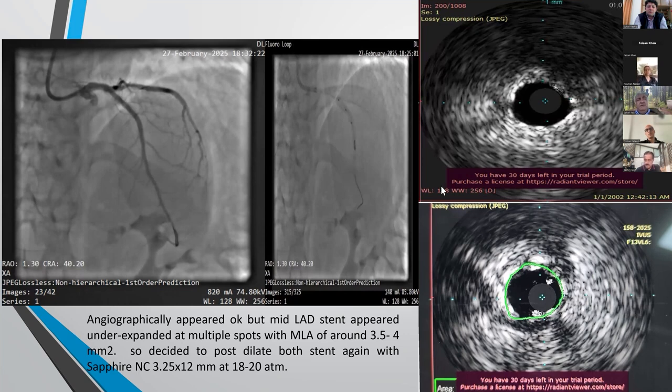And if you're going to use the same reused equipment on 4 patients, the first one really gets the best advantage, and the others, there's no right or wrong, but they're getting a reused one. So if they pay the same, that is an institutional question to be answered. But maybe in the guideline we should say what has to be screened for in order to use it.